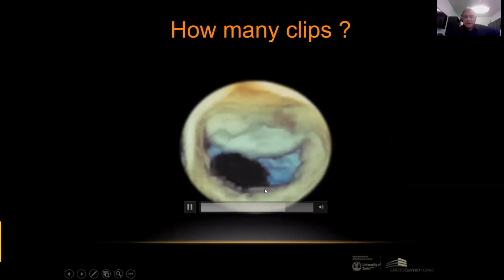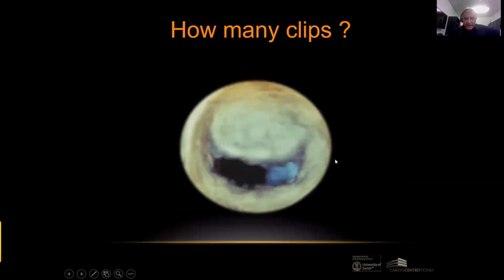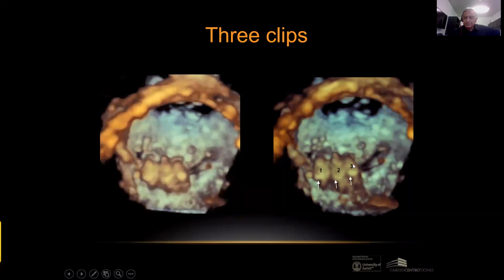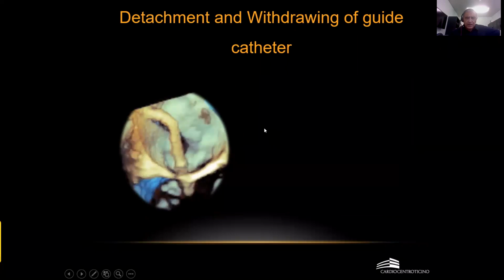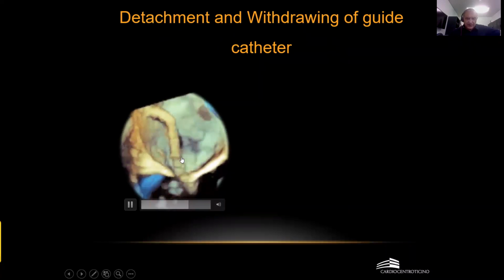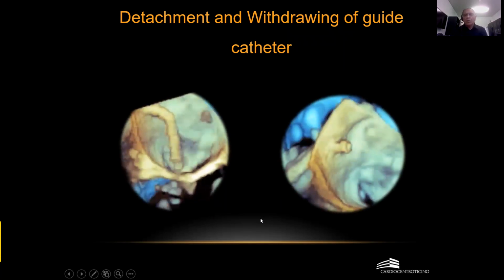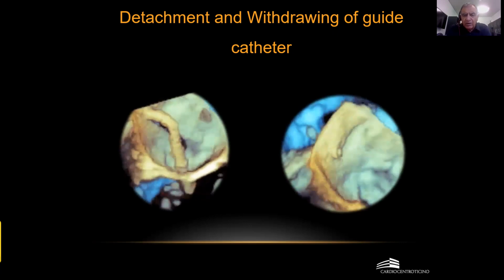How many clips here? Wow. In this case, which was end-stage cardiomyopathy, we put 3 clips, as you can see here, with a good result. Then we have the detachment of the catheter, as you can see here, which goes away from the left atrium into the right atrium. And this is the end of the procedure.